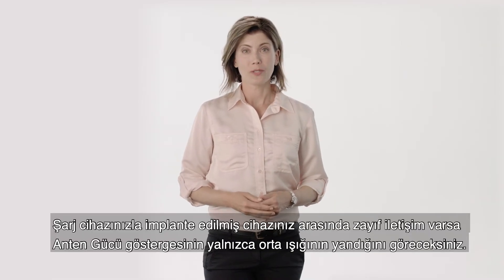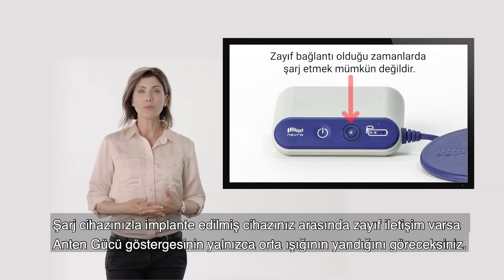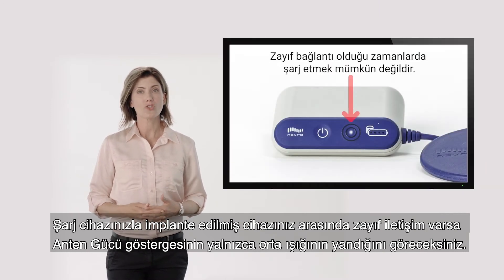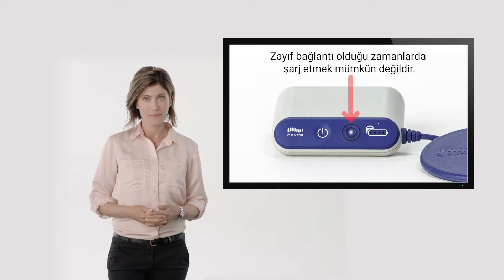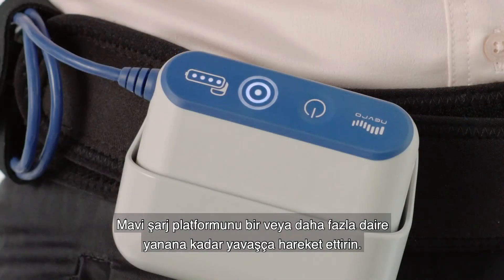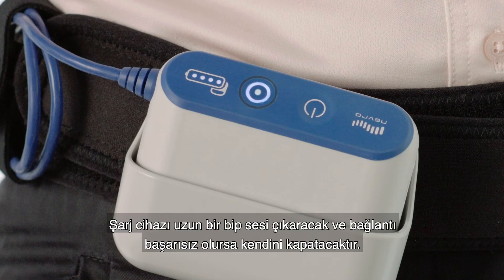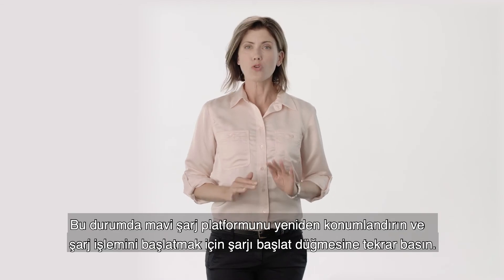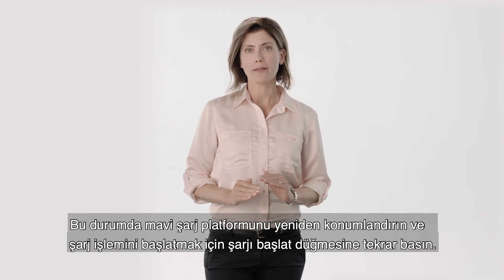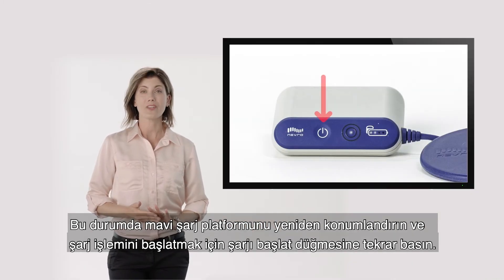If there is a poor connection between your charger and implanted device, you will see only the center light of the antenna strength indicator illuminated. Move the blue charging pad slowly until one or more circles are illuminated. The charger will sound one long beep and turn itself off if connection is unsuccessful. In this case, reposition the blue charging pad and press and hold the start charge button again to initiate charging.